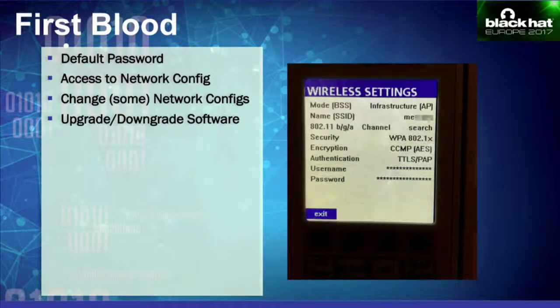We also noticed that there is an IRDA interface. Since, like I said, it wasn't connected to our lab network, our next goal was to connect this device to our lab network. And so we tried to spin up our own rogue wireless access point because we saw that it's trying to connect to a wireless access point, but it's not there. So we spun up our own rogue access point without any security settings, and it refused to connect to it. So I think it only connects to an access point with the same name, which has WPA or WPA2 enabled.